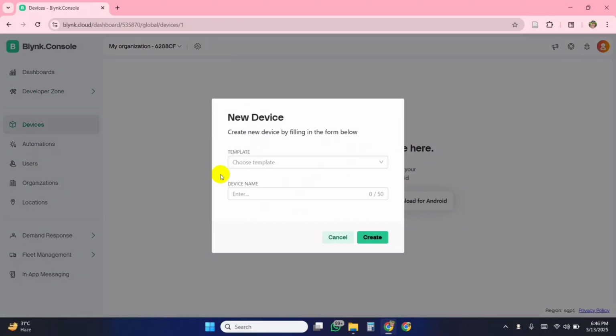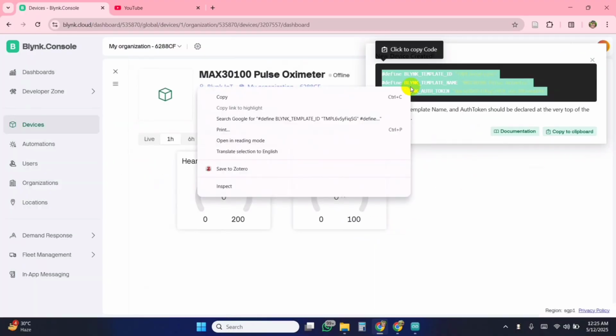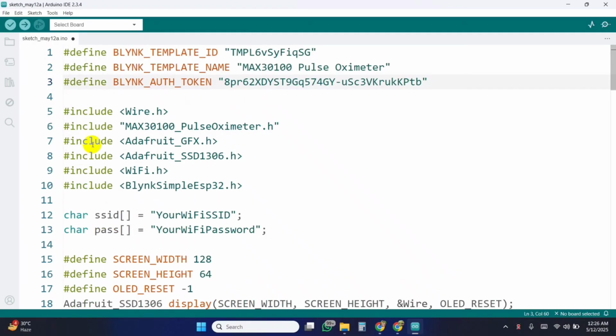Then create a device using the template. After creating a device, you'll receive a template ID, name, and auth token. You have to define them at the beginning of the code.